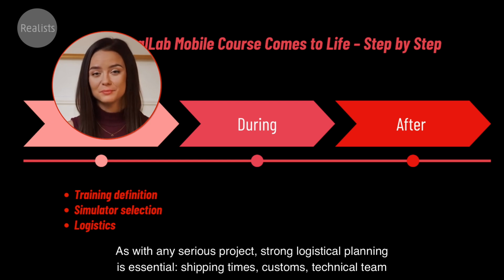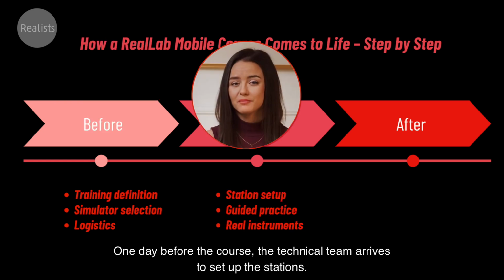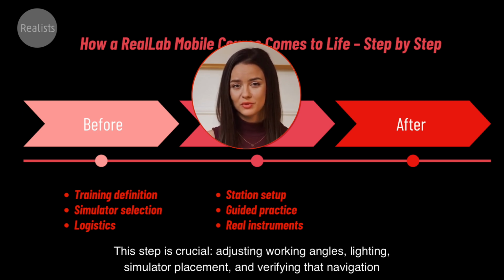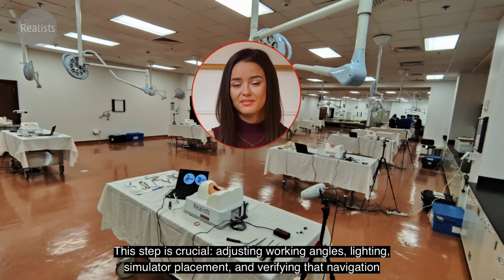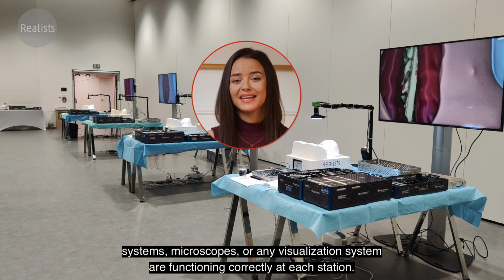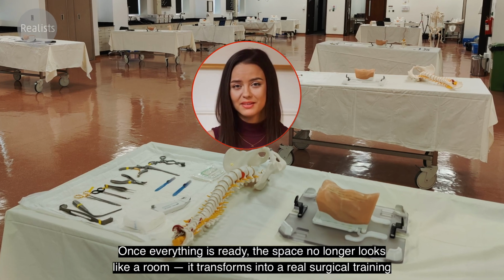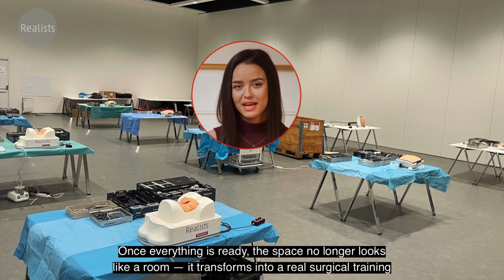As with any serious project, strong logistical planning is essential. Shipping times, customs, technical team availability, everything must align so that by the time setup day arrives, all is ready. One day before the course, the technical team arrives to set up the stations. This step is crucial: adjusting working angles, lighting, simulator placement, and verifying that navigation systems, microscopes, or any visualization system are functioning correctly at each station. Once everything is ready, the space no longer looks like a room. It transforms into a real surgical training environment.